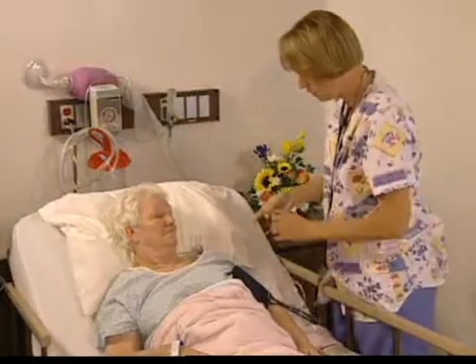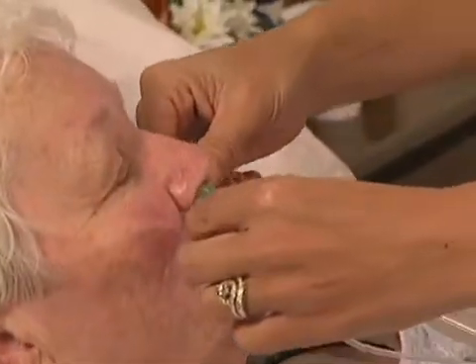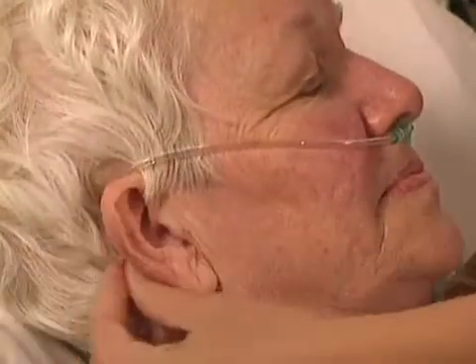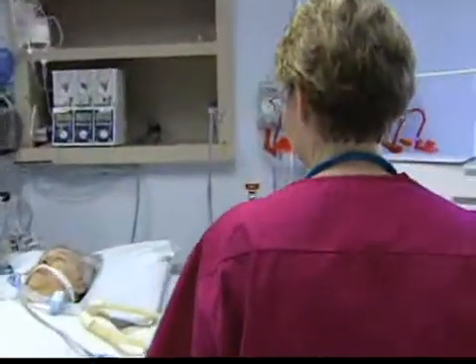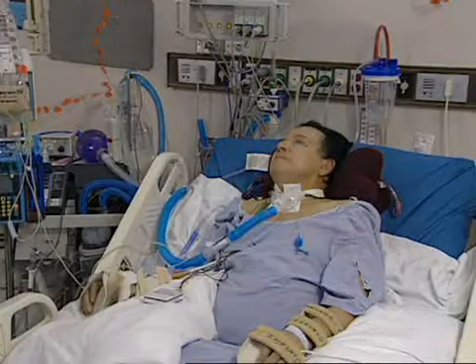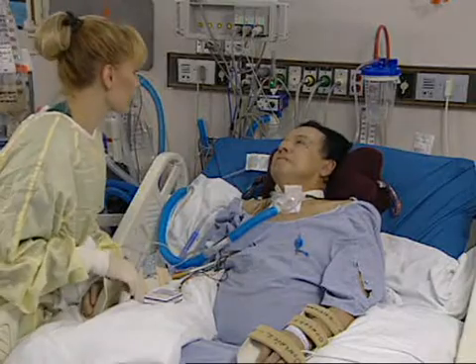Providing supplemental oxygen therapy is an important nursing responsibility. Skill in initiating therapy is essential, but equally important is your ongoing assessment, which enables therapy to be adjusted to your patient's needs in a timely manner for optimal therapeutic benefits.